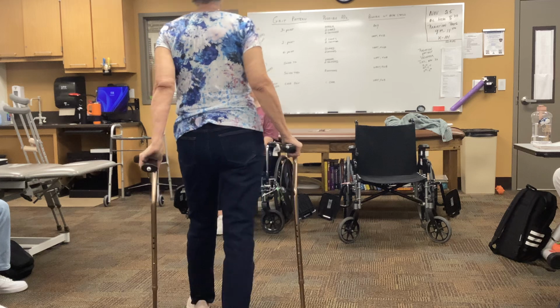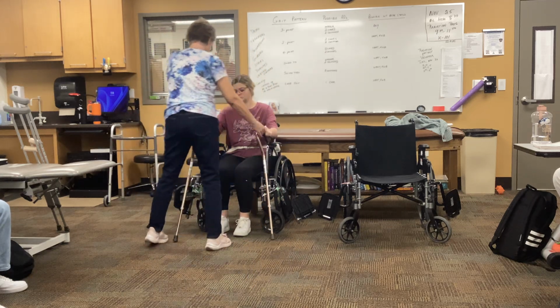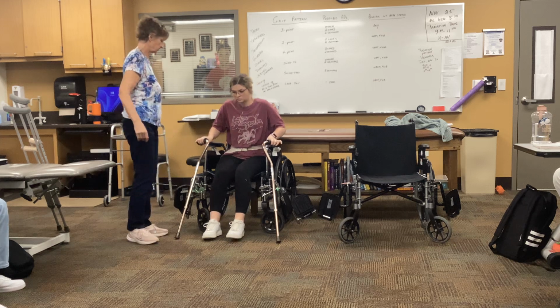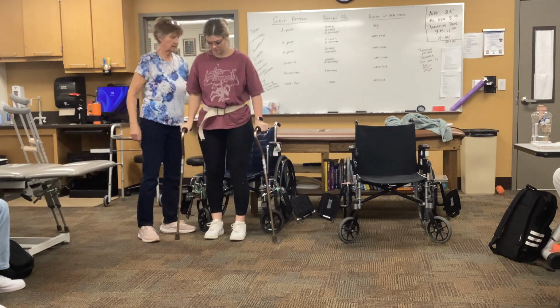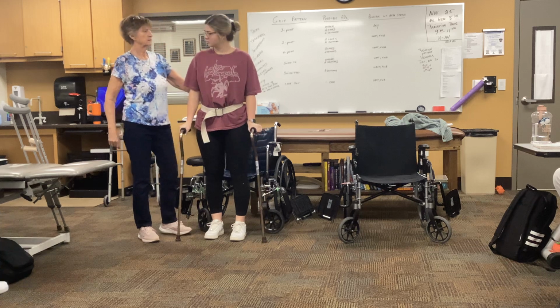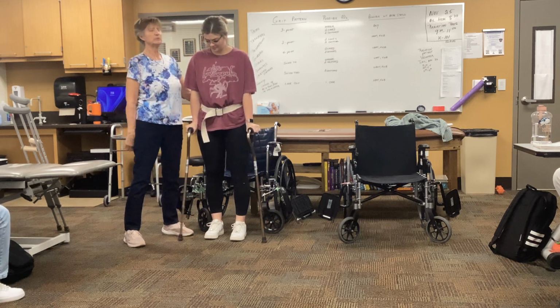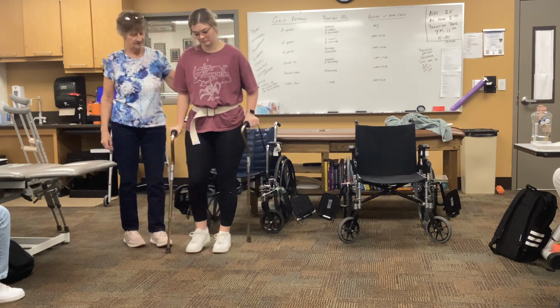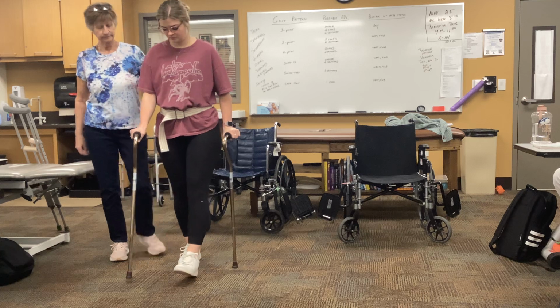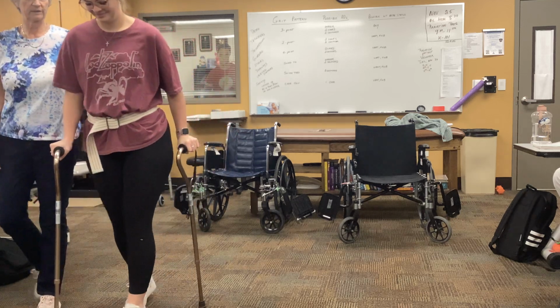Okay. All right, ready to give it a try? All right, so just a little scoot forward, push up, that's it. 4-point first? Okay, which one do you want to do first? Do the 2-point first, do the easy one first. Still takes some thought, at least in the beginning when you're learning.